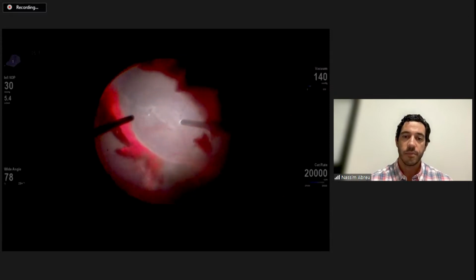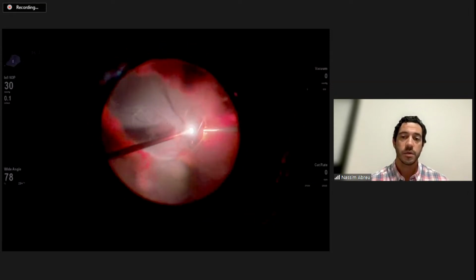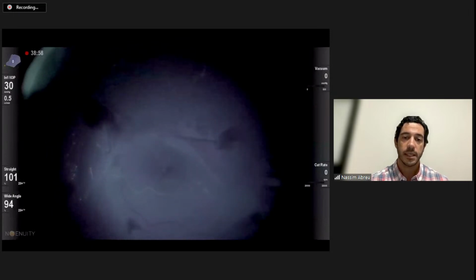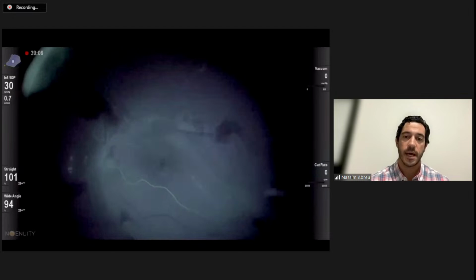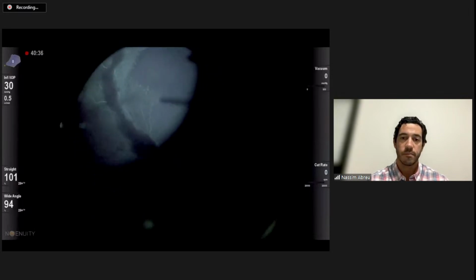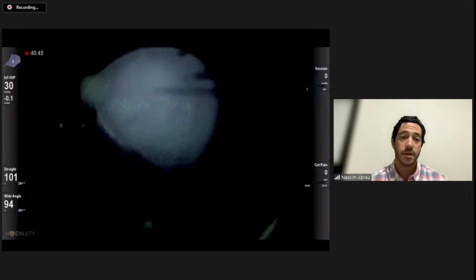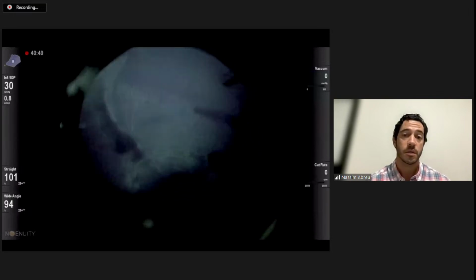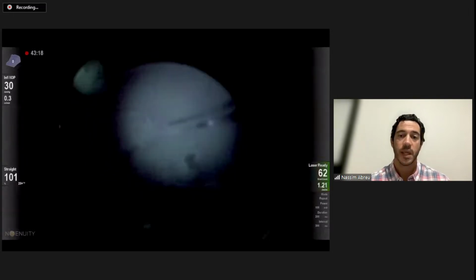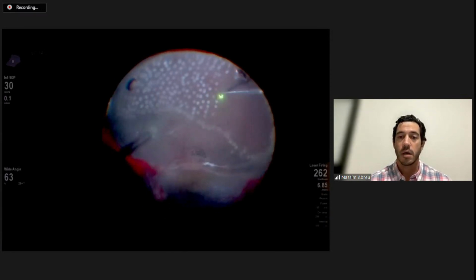This is a very pretty case of an ROP where we had some retinal detachment that we were not actually sure if it was retina or not. We could see some vessels coming up this kind of fibrous tissue, and after we cleaned up the blood and took that tissue out, we could see that we had some vascularized retina proliferating up under the tissue that we had already taken. So this was not apparent on normal visualization. Through intraop FA, we could actually delineate the area of ischemia and just treat the non-vascularized and non-perfused retina and leave the viable tissue without any laser treatment at all.